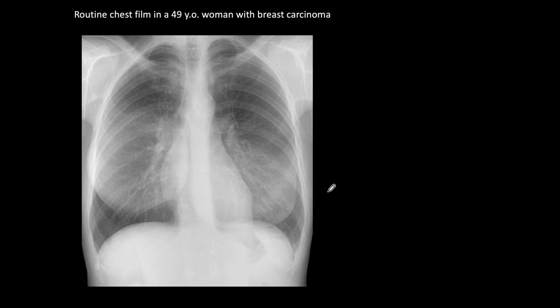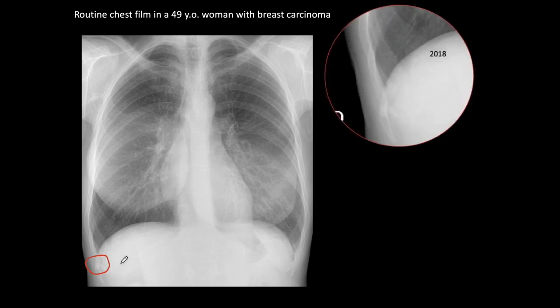Another patient: routine chest film in a 49-year-old woman with breast carcinoma. You see the elevated breast, the prosthesis, and the skeleton is apparently normal. But if we look very carefully, we detect a sclerotic lesion in the 11th rib. There it is. We can see it better in the coned-down view — sclerotic lesion in the 11th rib.